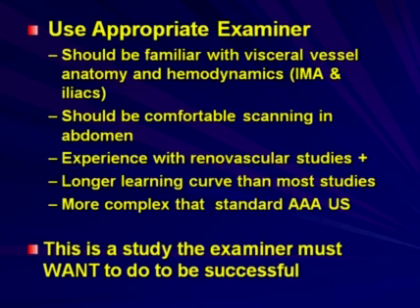The examiner should be very familiar with visceral vessel anatomy, particularly the IMA and iliacs. They should be very comfortable scanning in the abdomen, and I found that experience with a lot of renal studies, renovascular studies, helps them in segueing to this exam.